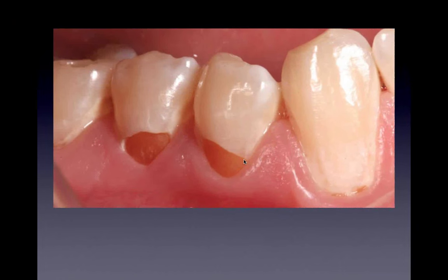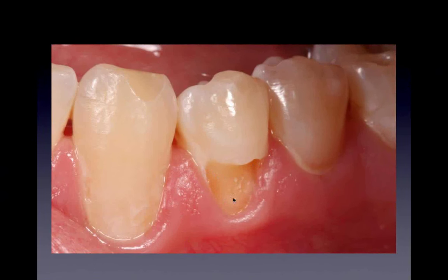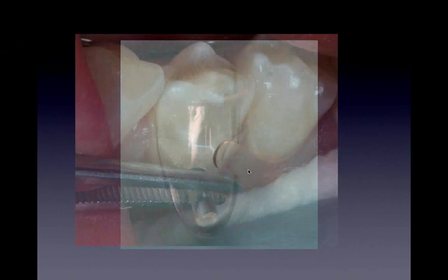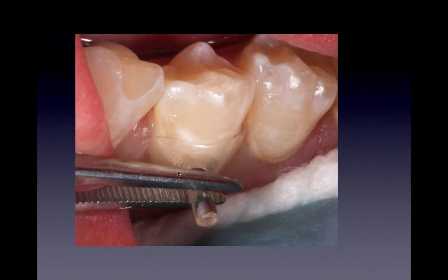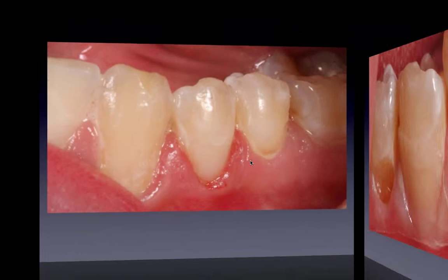You can see at the lower right, lower left, a lot of preparation interproximal. Make sure you get all that decay out and clean it out. Here's the cervical matrix. In this case, I did not use a retraction cord. The tissue was very clean. I used the cervical matrix, acid etch, dentin bond, flowable composite restoration, and then just squeeze it into position, cure it twice, and then start polishing. It's a really great way to get a good contour on the cervical erosion cases.